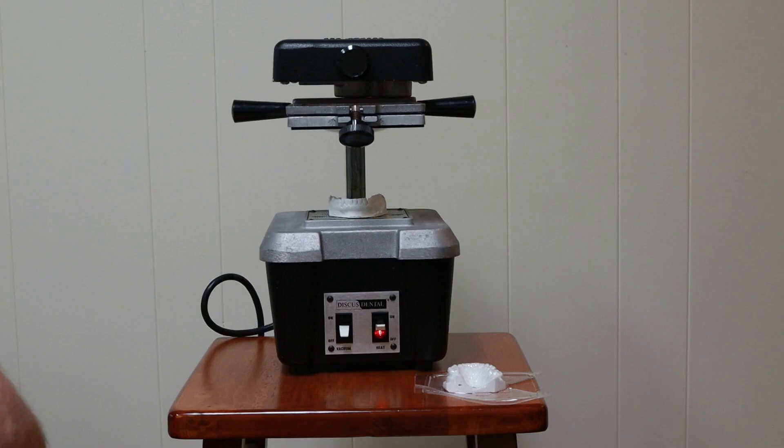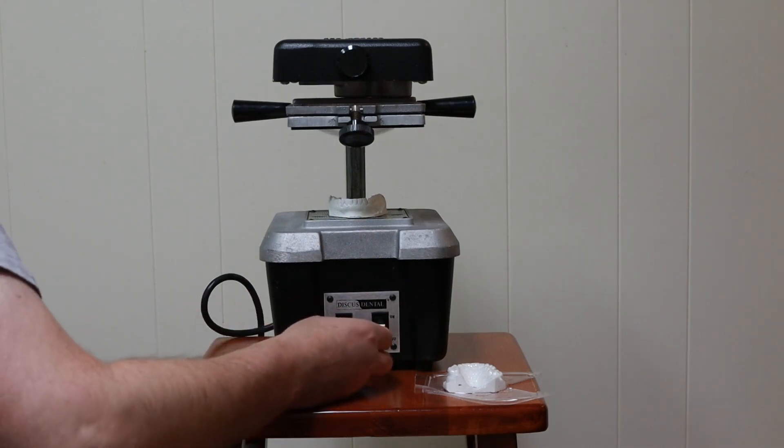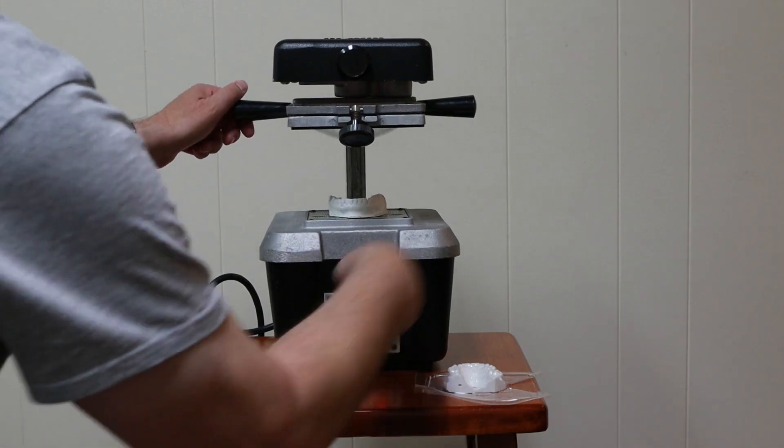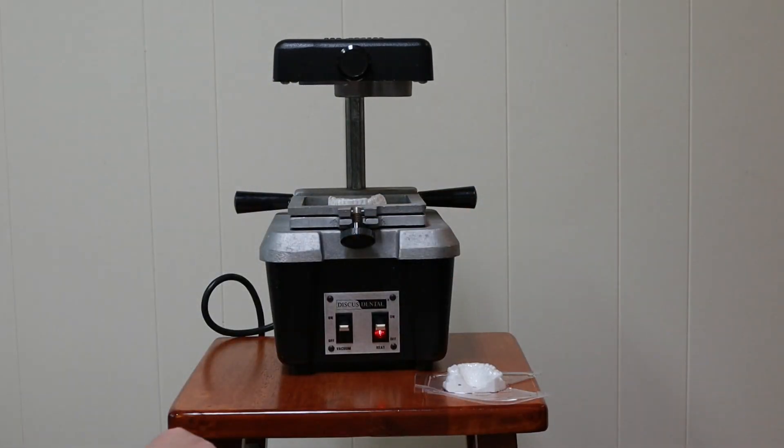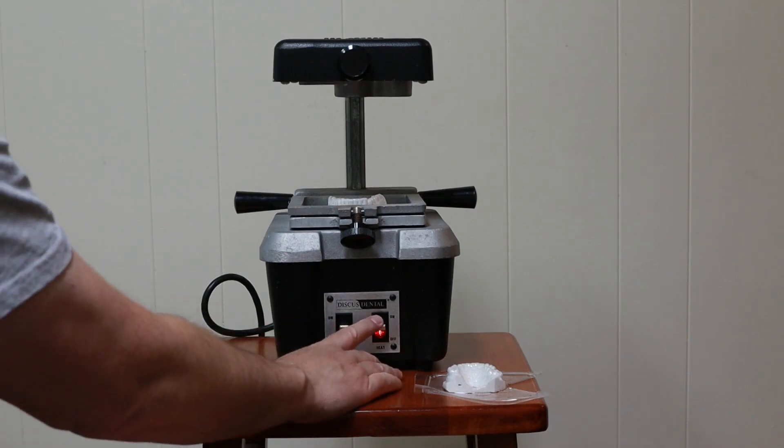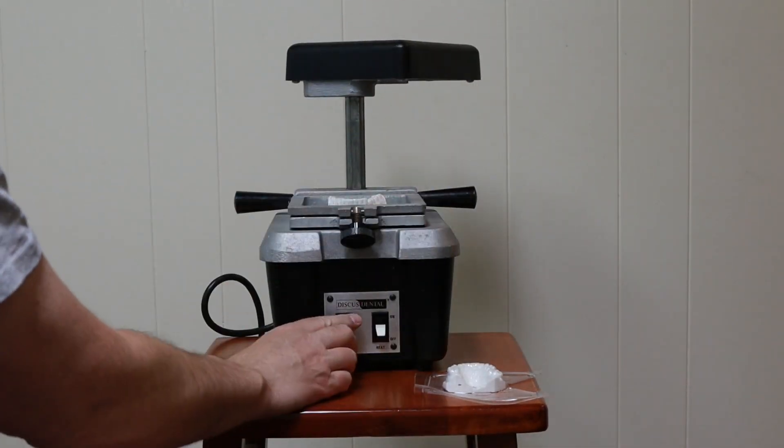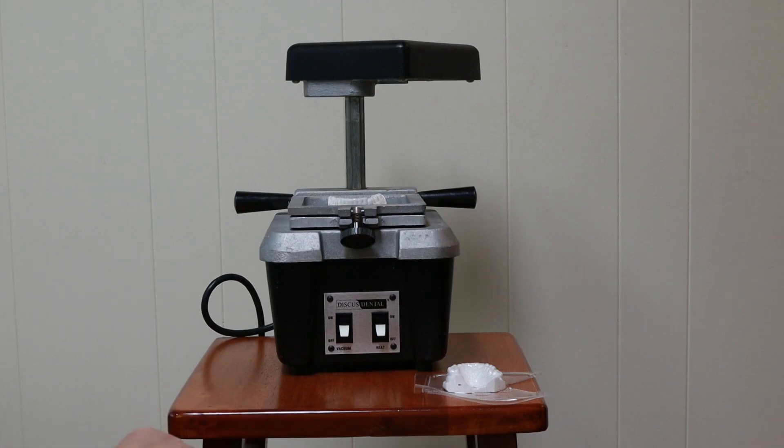Alright, we're getting a sag. When it gets to sag about an inch, there we go. Turn the vacuum on. Drop the tray, let it run. Turn the heat off. Let's take that out of the way. Turn the vacuum off.